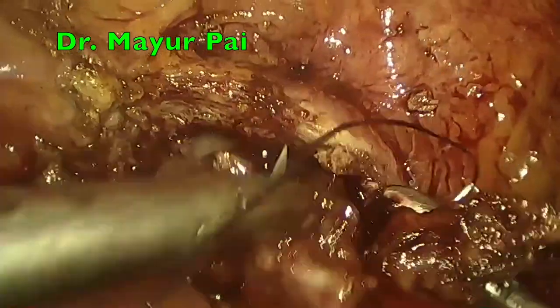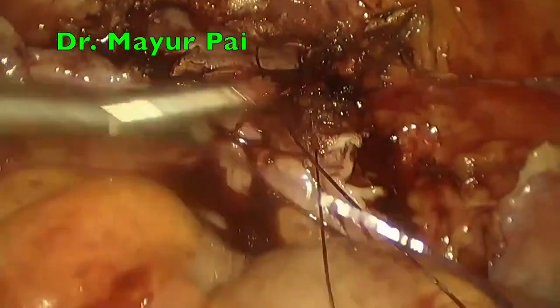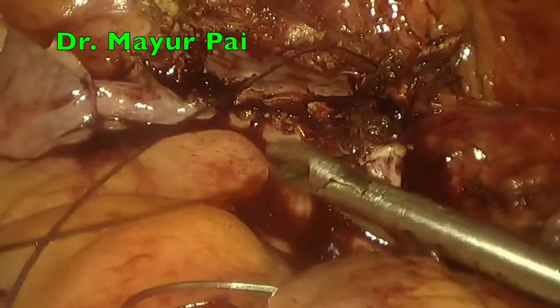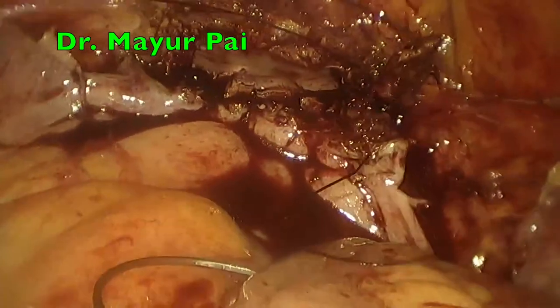At the end of the procedure, the vaginal vault is sutured using 2-0 Vicryl on a cutting needle using running suture from right to left. We use a combination of needle holders on either side.